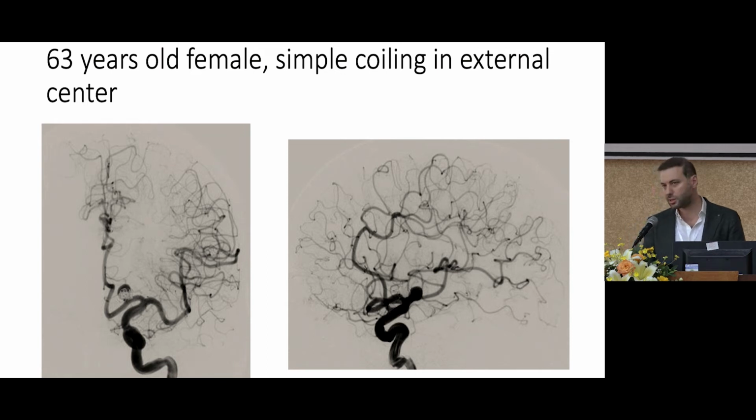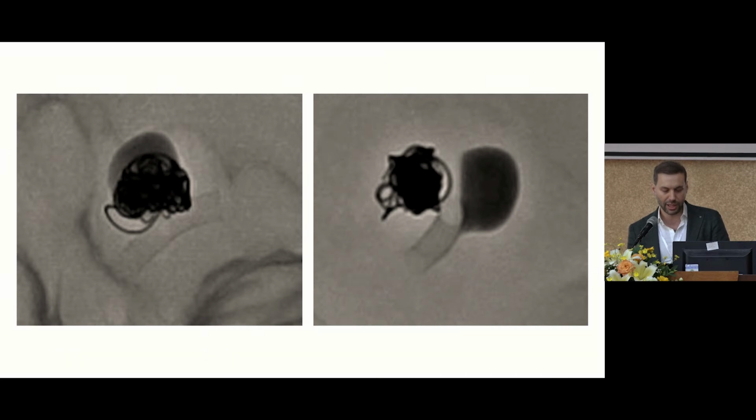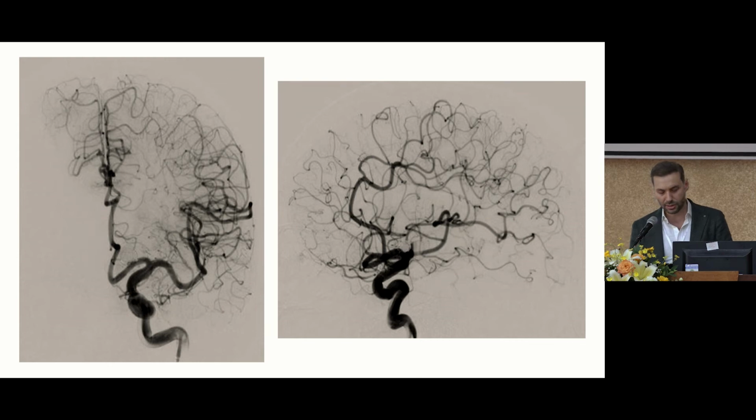And what we did, we didn't want to add some coils inside, just a flow diverter stent, SILK Vista Baby, and you can see nice stagnation just after the deployment. This is AP and lateral after the procedure. Maybe at the lateral you can see some filling at the posterior border of the aneurysm. At the 6-month control, AP, very nice reconstruction at the A1 segment, and lateral there is no filling at all at the aneurysm, with a very nice result.